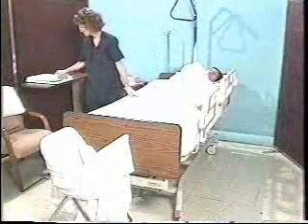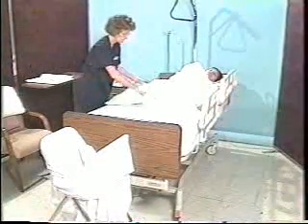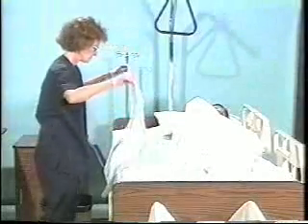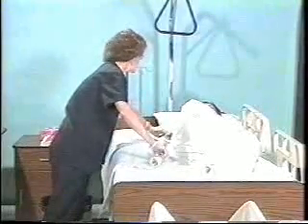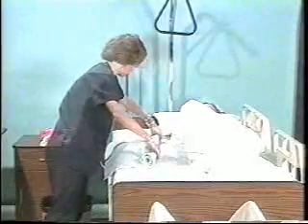The caregiver is going to use an incontinence pad. Sometimes it is used instead of plastic and cotton draw sheets. The incontinence pad protects the bottom linens from soil and can be used as a lifter sheet as well. The caregiver talks to the patient during the procedure, making sure she's comfortable.